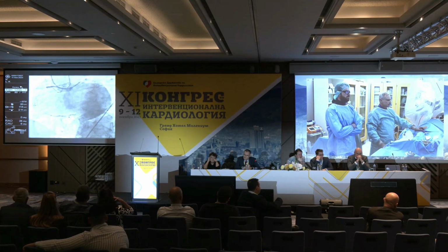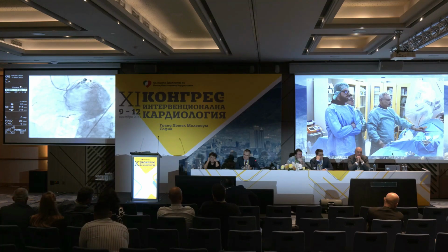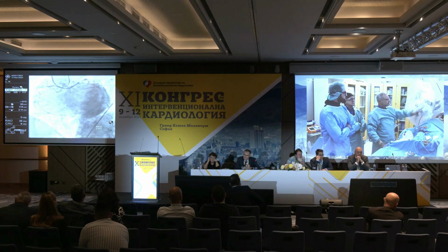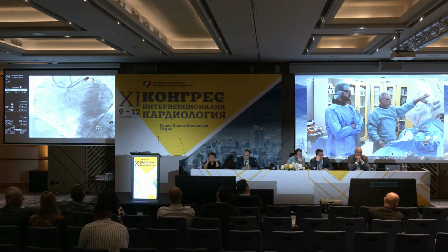The right is a very big vessel. And what we see here is that there is a blunt cap. And it's a very big vessel. When we say blunt, blunt. And there is a branch that is a little bit more proximal that doesn't affect the proximal cap.